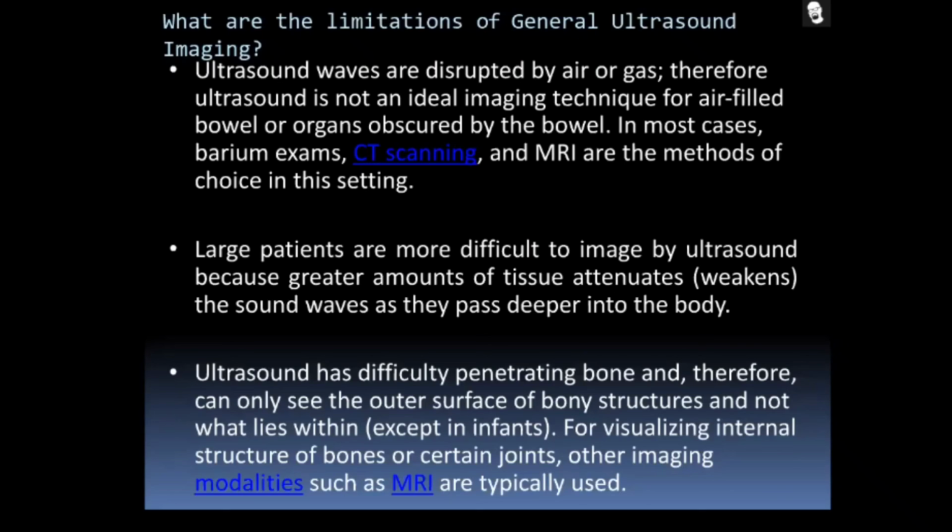It is not an ideal imaging technique for an air-filled bowel or an organ obscured by this particular bowel. In most cases, barium exams, CT scanner and MRI are purposely used for that imaging. Large patients are more difficult to image by ultrasound because of the greater amount of tissue attenuation as the sound waves pass deeper into the body.